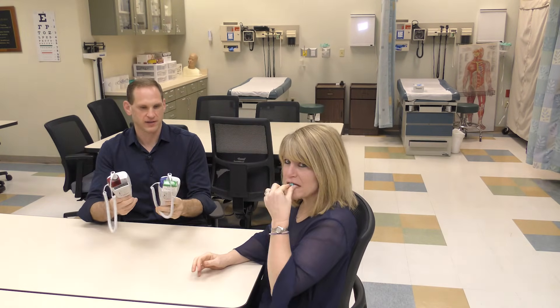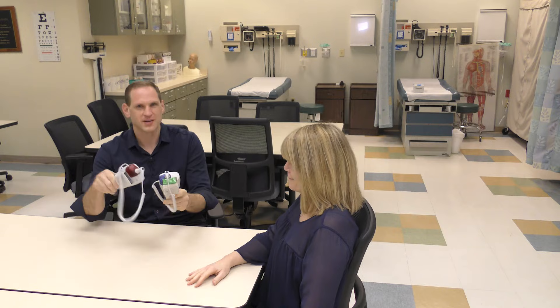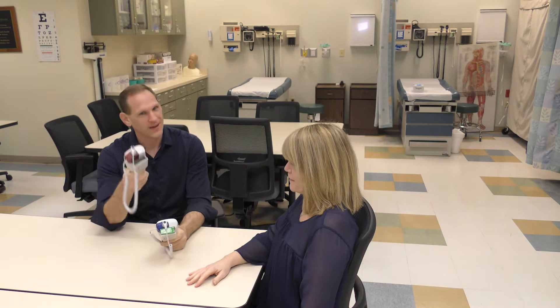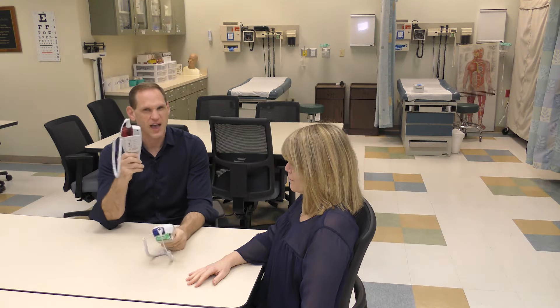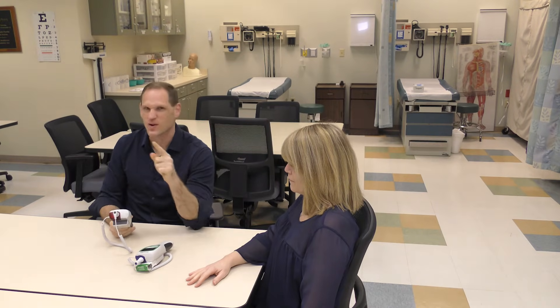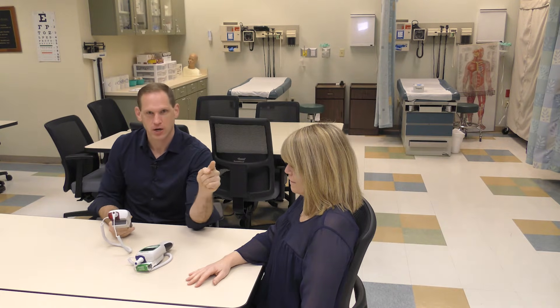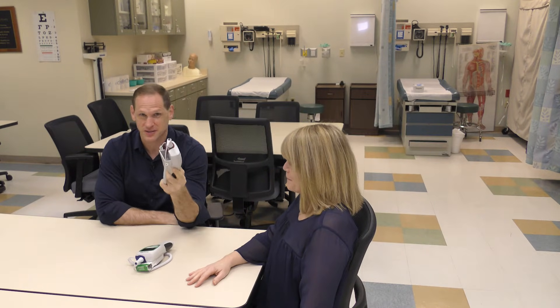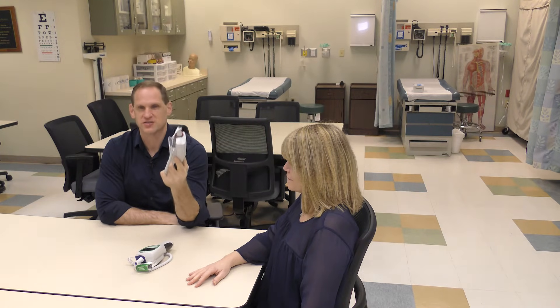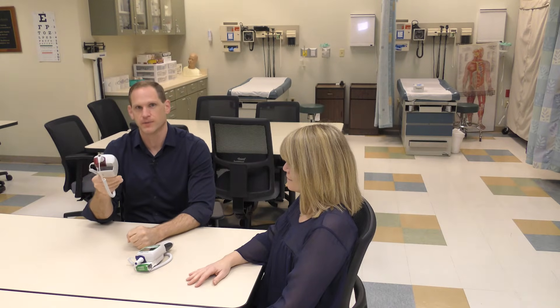Now we're going to show you how to do an oral temperature with one of these Welch Allyn SureTemp thermometers. These probes look similar but they are not the same. This one is red and this one is blue. Blue goes in the mouth; red goes in the rectum. If you ever come at a patient with the red one to put in their mouth, you are not going to be a nurse. Every year there are horror stories of a student who tries to put the rectal probe in a patient's mouth — don't do it!